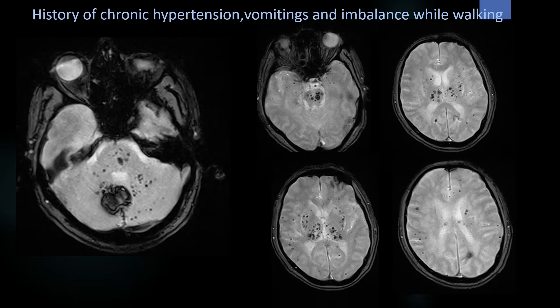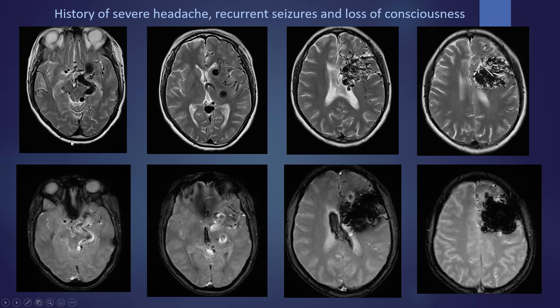A case of chronic hypertension with vomiting and imbalance shows a bleed in the right cerebellum with multiple punctate microbleeds in the brain stem, cerebellum, capsulonglionic region, and a few lobar bleeds. Another case of severe headache, recurrent seizures, and loss of consciousness shows multiple abnormal leash of blood vessels and serpiginous flow voids in the left frontal lobe, with a large feeding artery from the left MCA — consistent with AVM with bleed, lobar bleed, and intraventricular hemorrhage.